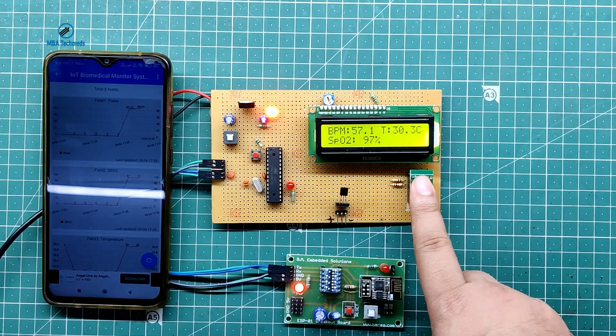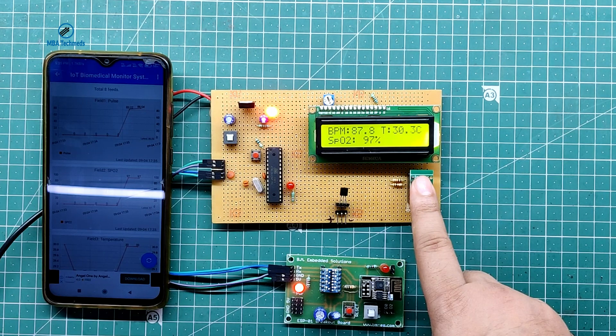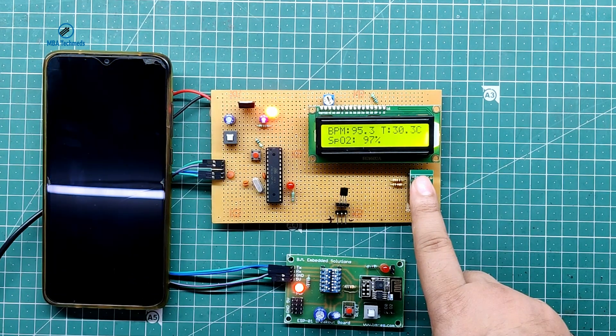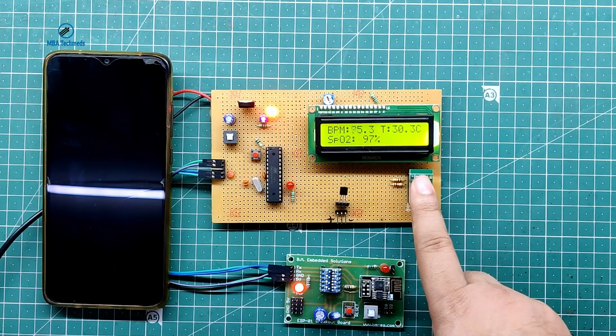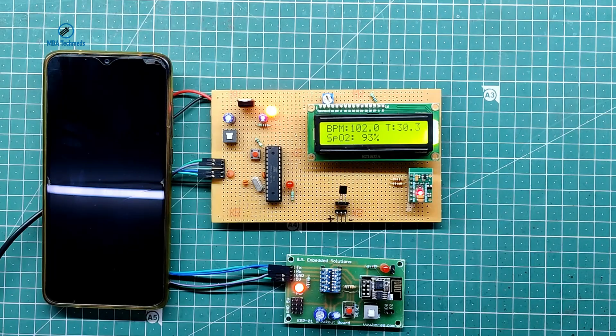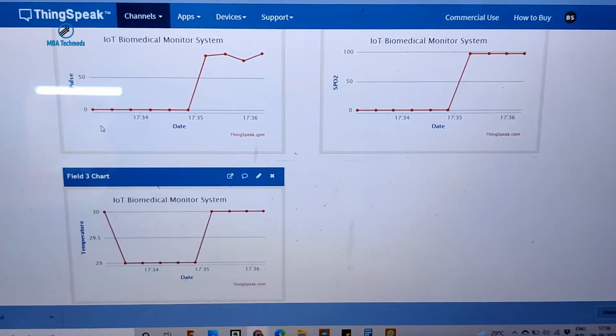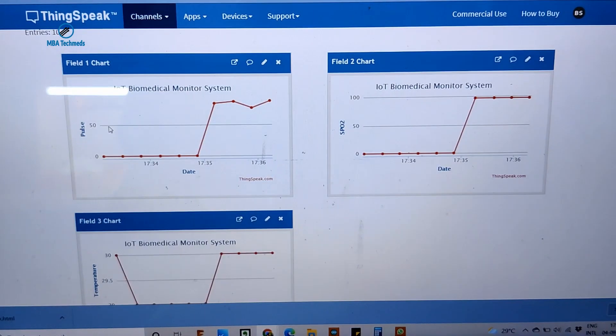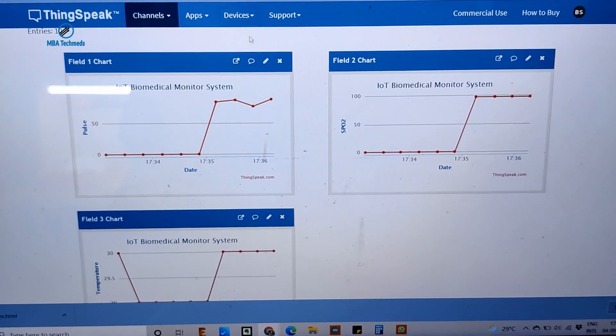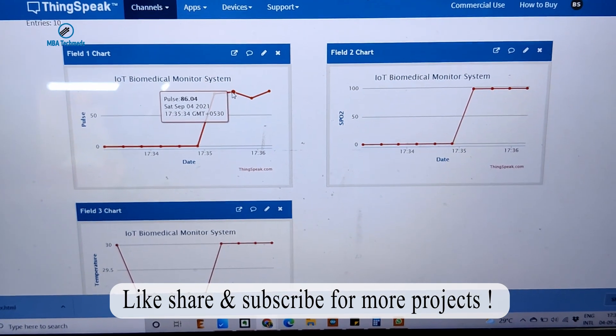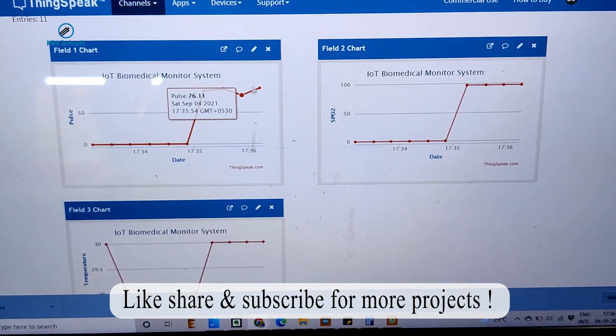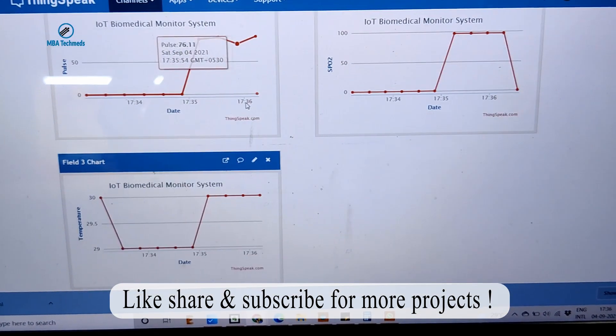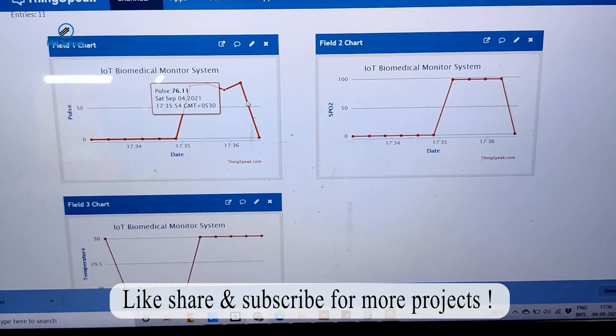I will also show you the demonstration of the website interface. So this is the website interface, you can see Pulse varied from 85 to 87.